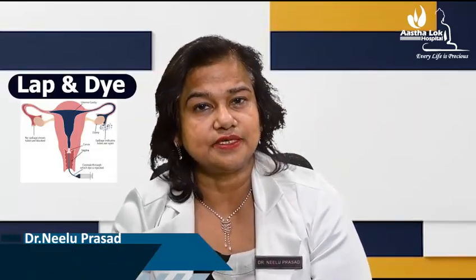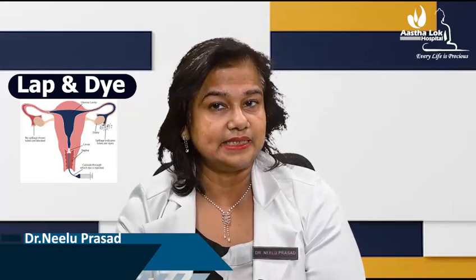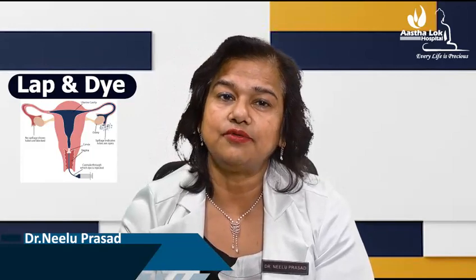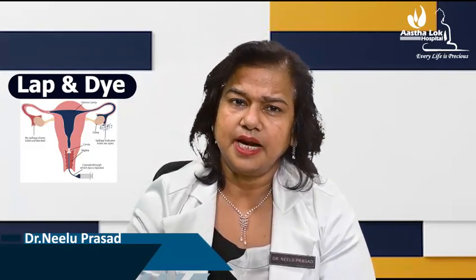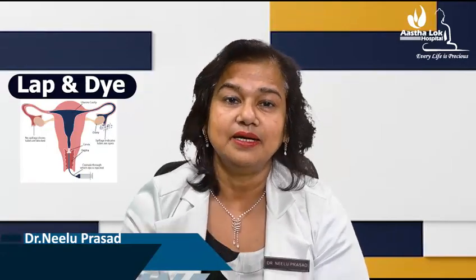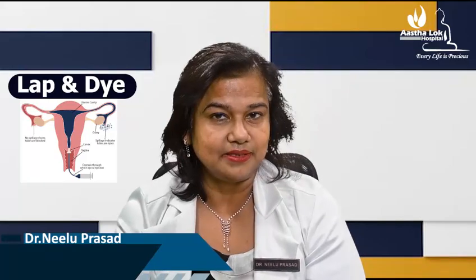Lap and dye test is a diagnostic procedure used to evaluate the patency of the fallopian tube, which is crucial for fertility. It is often performed as a part of fertility evaluation when the woman is having difficulty in conceiving.